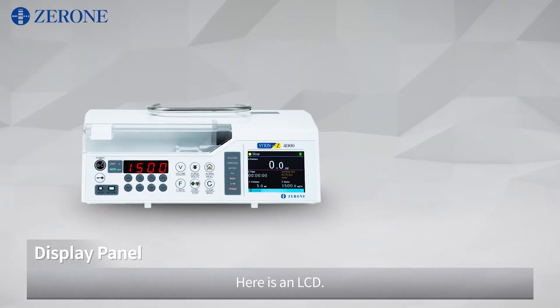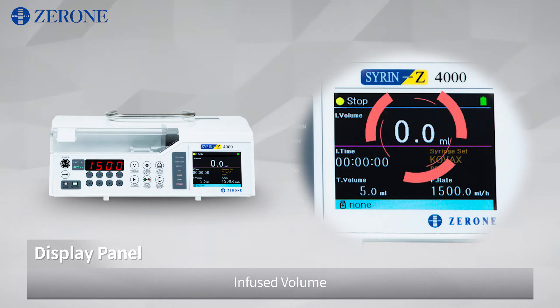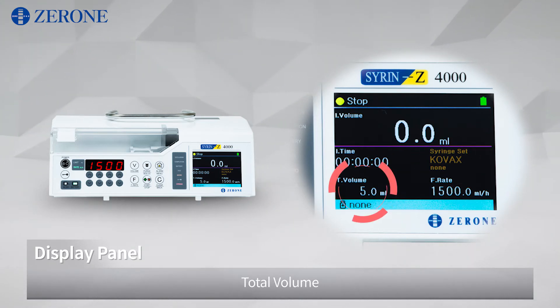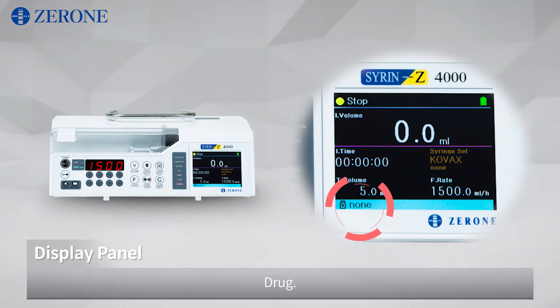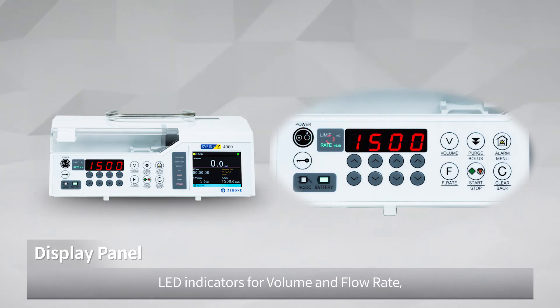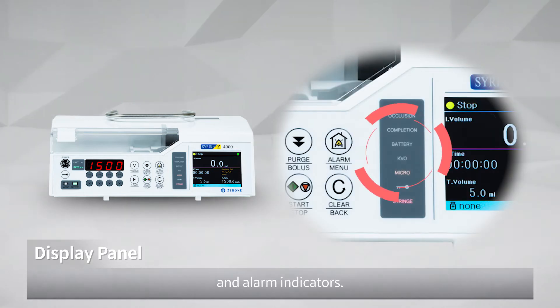Here is an LCD. It shows status, infused volume, infused time, syringe set, total volume, flow rate, and drug. We can see the FND for total volume or flow rate, LED indicators for volume and flow rate, LED indicators for the power of the battery and AC-DC, and alarm indicators.